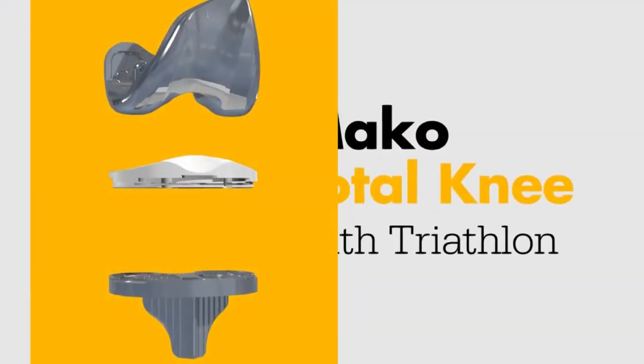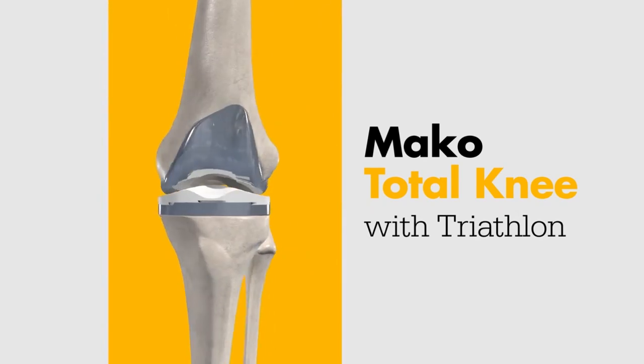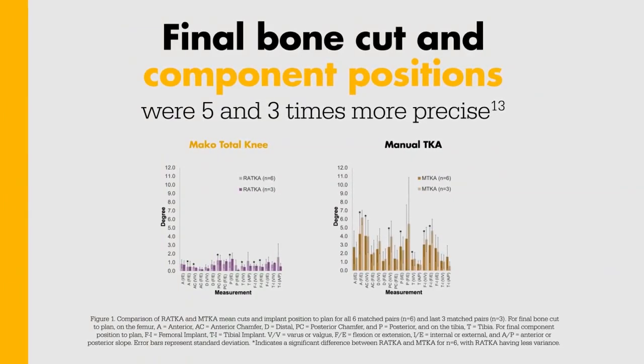Once bone preparation is complete, you'll place the components using Triathlon instrumentation. In a cadaveric study, on average, MAKO Total Knee final bone cuts and final component positions were 5 and 3 times more precise to plan, compared to the manual TKA control, respectively.